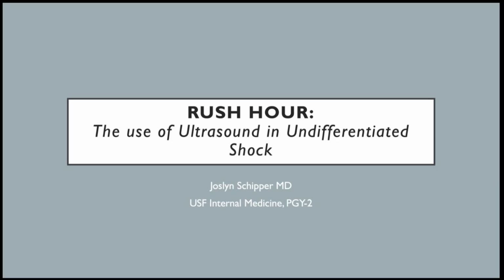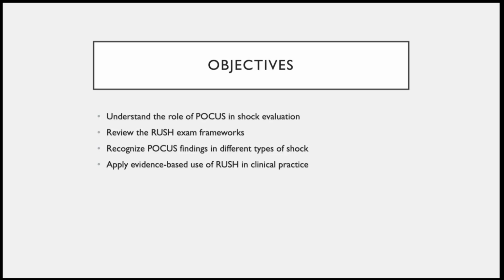The title of my presentation is Rush Hour, the Use of Ultrasound in Undifferentiated Shock. So the objectives for this presentation, by the end of it, I hope you'll understand the role of ultrasound in the evaluation of shock. We'll review different frameworks for how to approach the rush exam, and you'll be able to recognize different POCUS findings in various types of shock, and we'll apply some evidence-based use of rush exam in clinical practice.